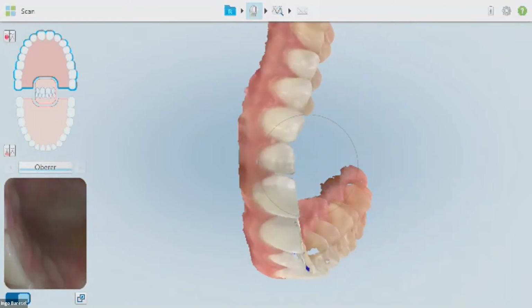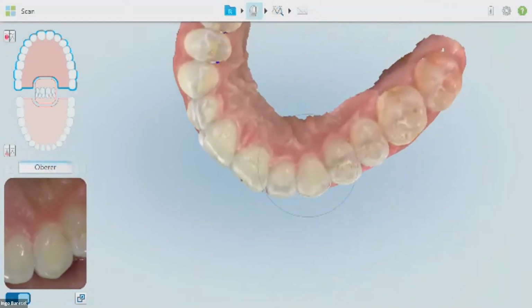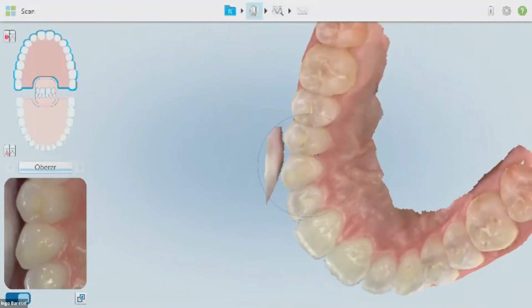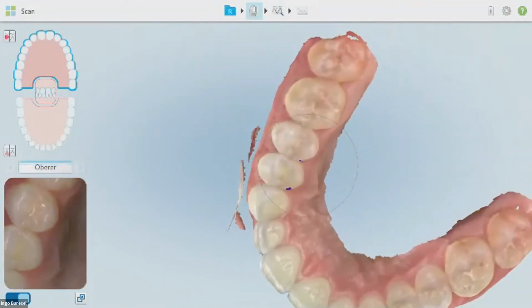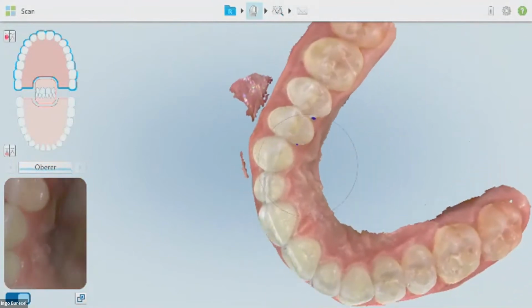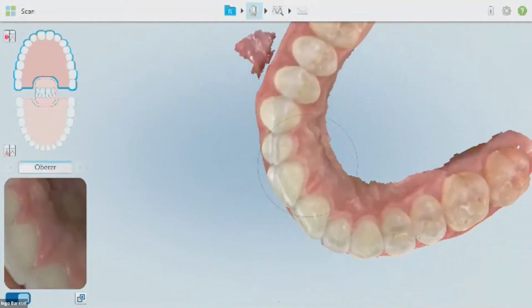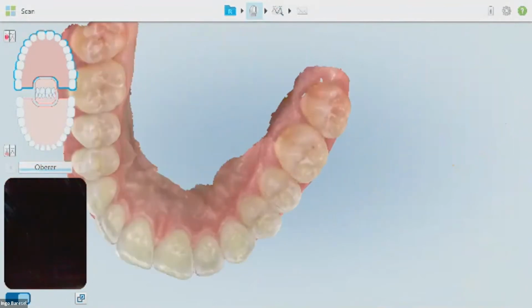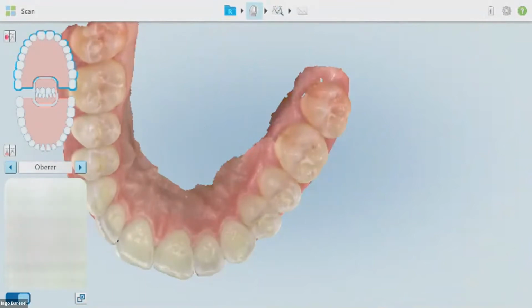And that's it. So everything is scanned. Sorry, my cable is a little bit short because the scanner is that far away. You see, I scanned some buccal areas. The modern scanners all have an AI. They are removing all those areas, as you see. So really, really, really easy. And we now will show you.